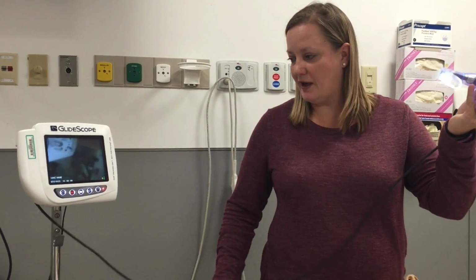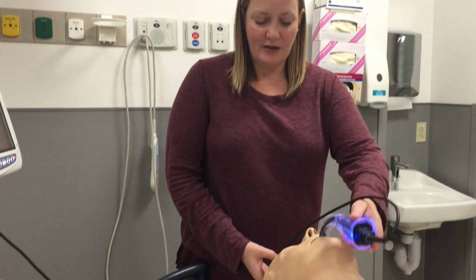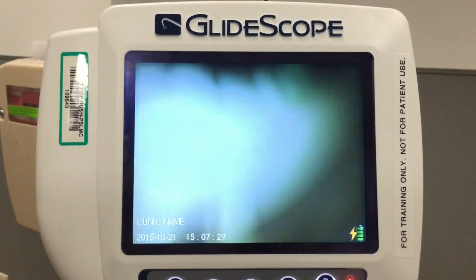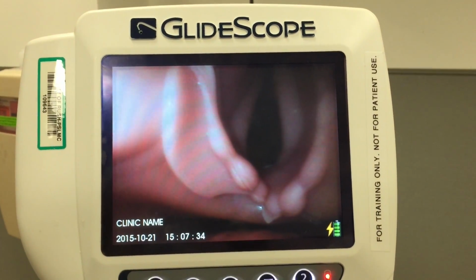You will hold the glide scope in your left hand, and you will place the glide scope in the patient's mouth, and you will watch the screen until you see what you need to see. So as you can see, this is the airway that we're looking for.